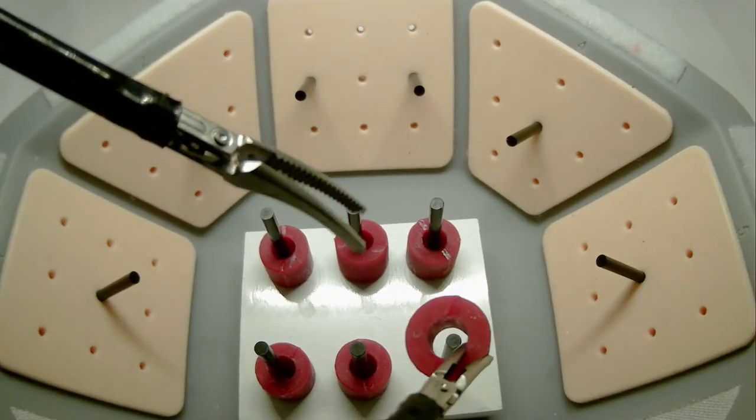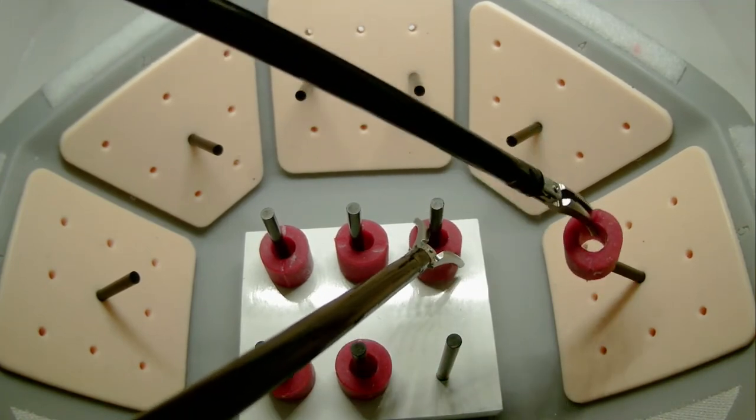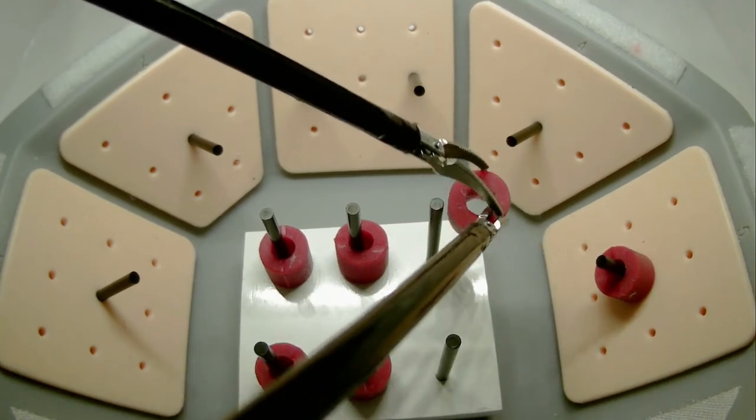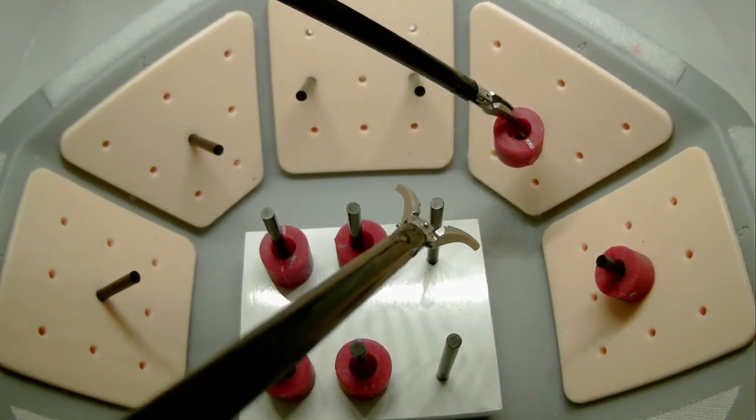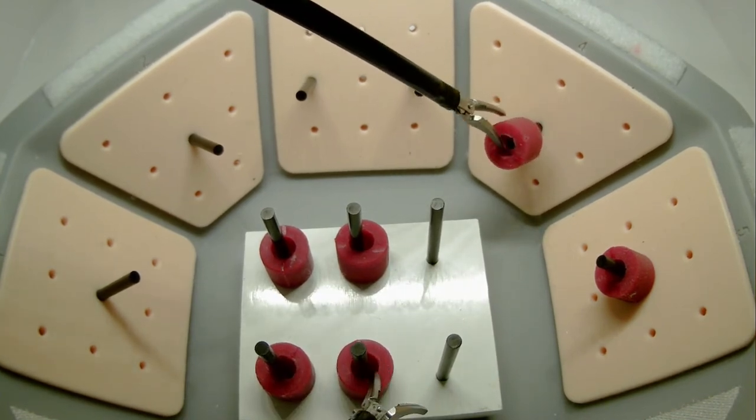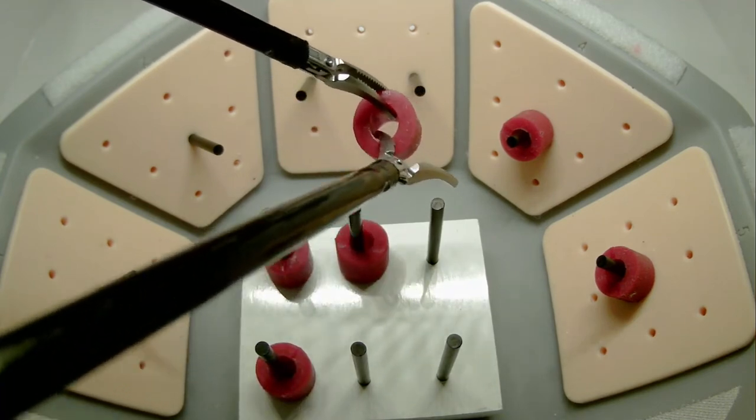While you are not required to utilize either your non-dominant or dominant hand, you are required to transfer the bead from the hand that you pick it up with to your other hand before placing it onto the sidewall peg. You are required to perform at least one transfer, but you may perform more than one transfer if necessary.